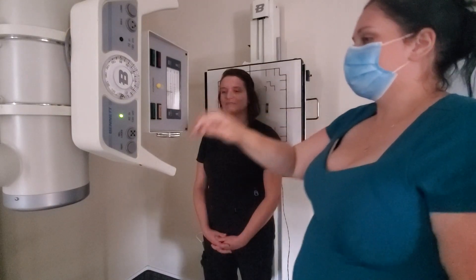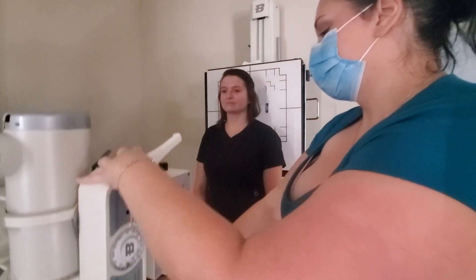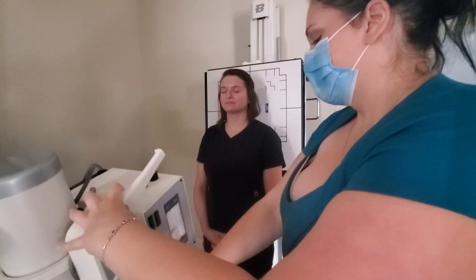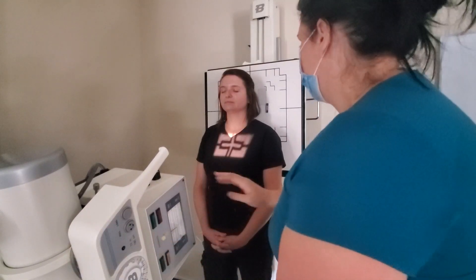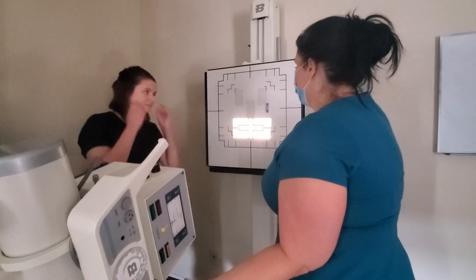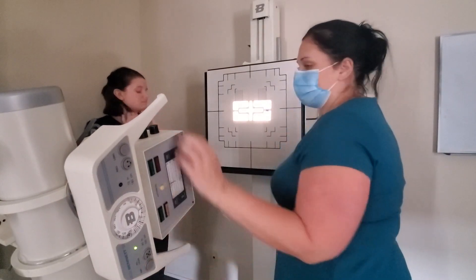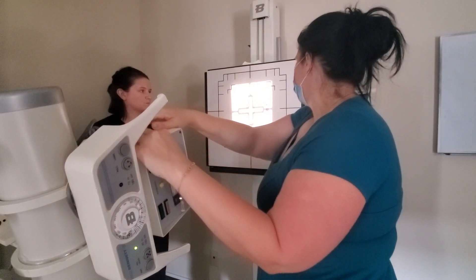From here I'm going to do the AP axial C-spine. This is a 10 by 12 lengthwise cassette and you're going to use a 15 to 20 degree cephalic angle, aiming at C4. I always like to make sure that my collimated field is open to the correct size first since we are not in a digital room, so I'll get that all set up.